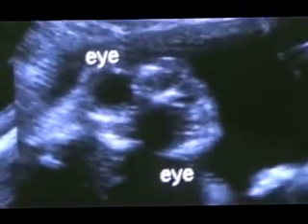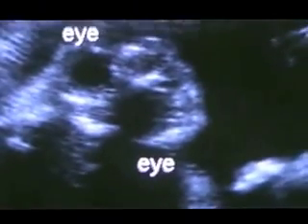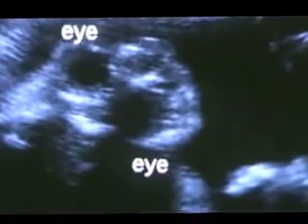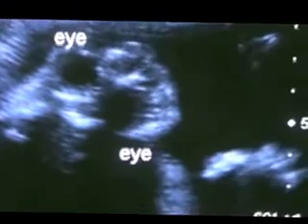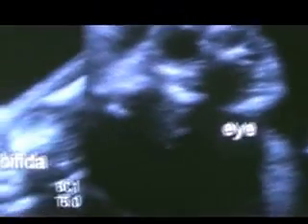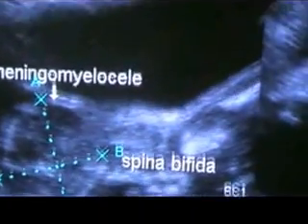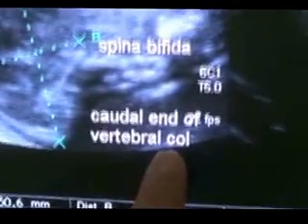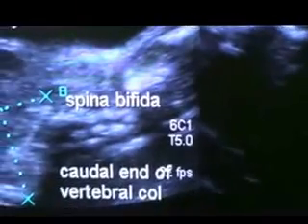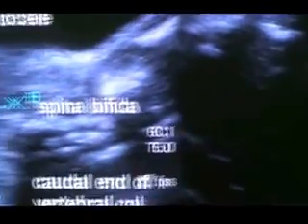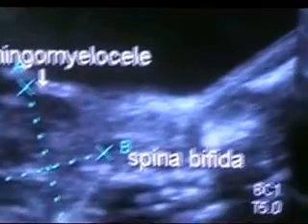For the same patient I have fuzzled the image to show you this frog's eye appearance of anencephaly which this fetus is suffering from. As you can see the two eyes in this image. On the other side, this is the caudal end of the vertebral column — it is opened up, spina bifida — and you can see a multi-layered cystic area extending from its caudal end.